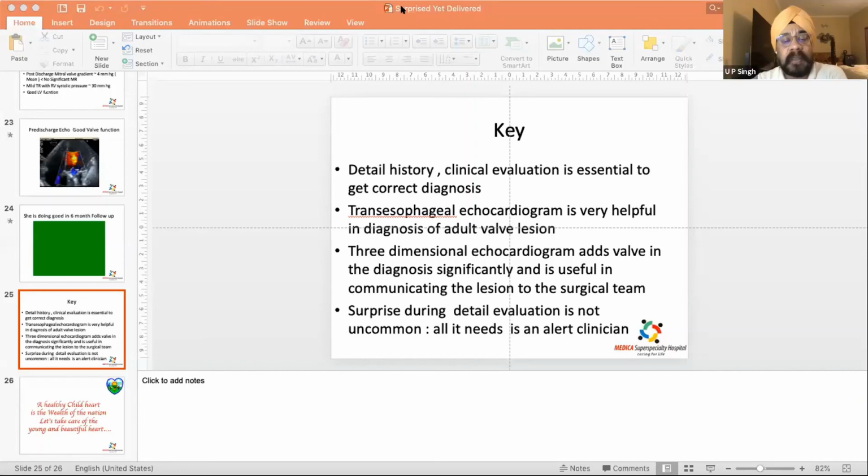In the context of the patient who underwent device closure with a 46 mm device, is there any role of measuring total septal length when considering use of large ASD devices? Not really. Can future remodeling after device closure lead to erosion later? So far I have done 4 cases of 46 millimeter in Kolkata.